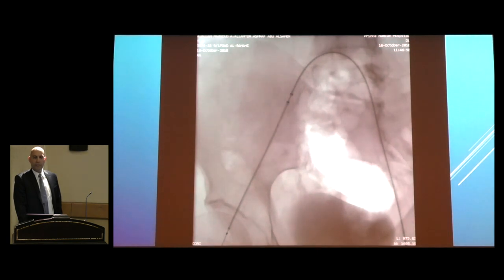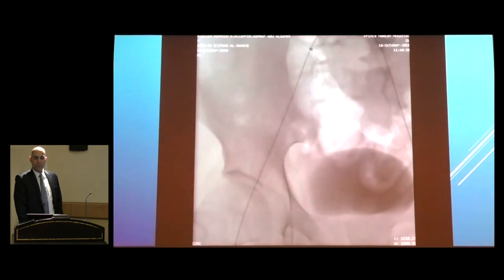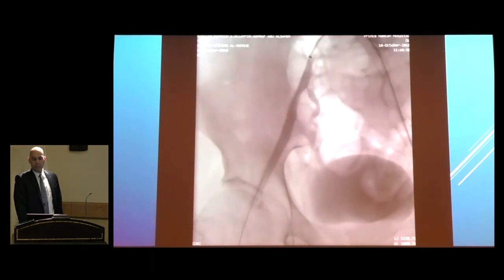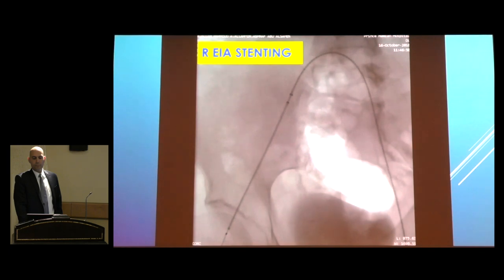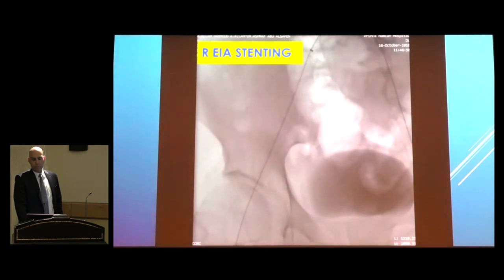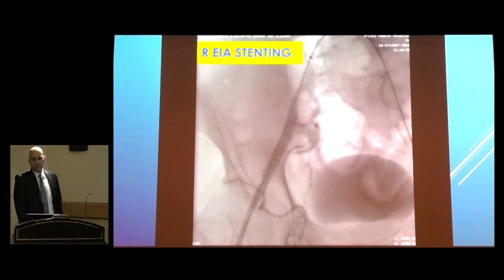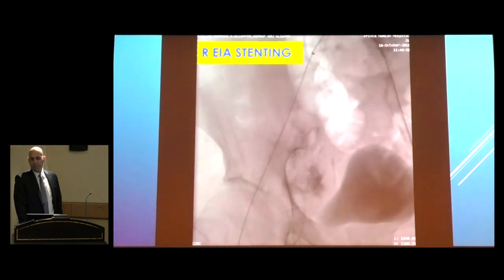We still had to treat the iliac CTO. An Expander stent was used and deployed. After deployment, you can see very nice inflow. There was a minor issue in the last angiogram, but after minor dilatation everything looked good.